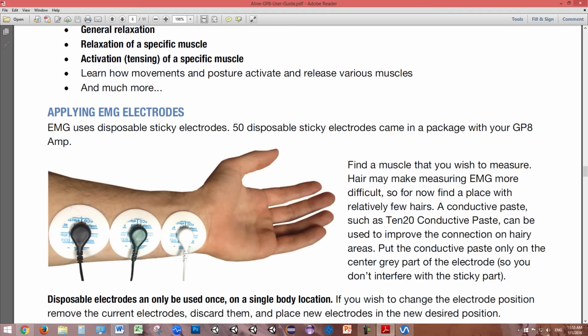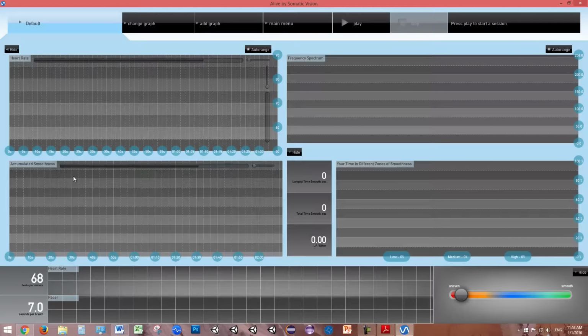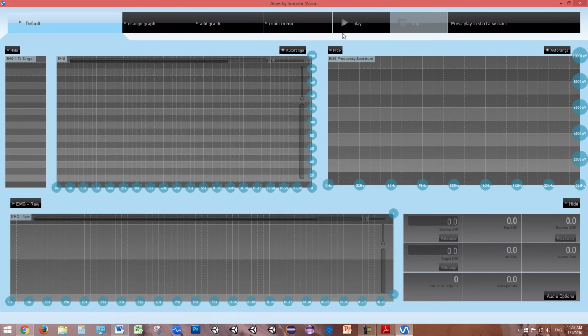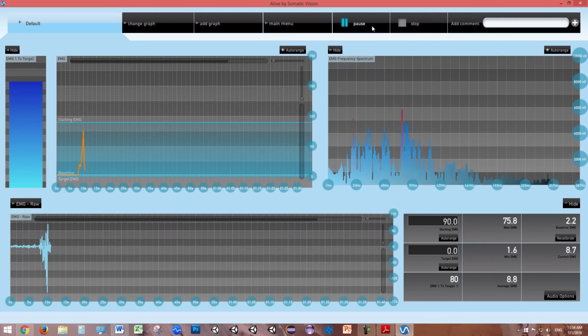To train a muscle, place 3 sticky electrodes in a line in the direction of the muscle fibers. For an easy demonstration, you can place these in a line in the direction of the muscle on the underside of your forearm. Then, from the Alive main menu, click Graph Training, then choose the EMG graphs. Click Play. Tense and relax your wrist muscles, and watch the changes in the EMG graphs.